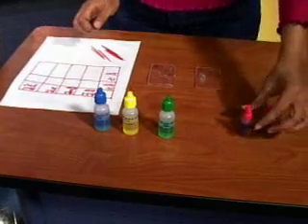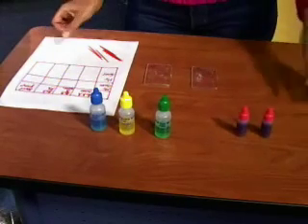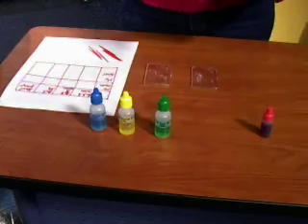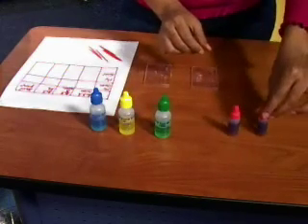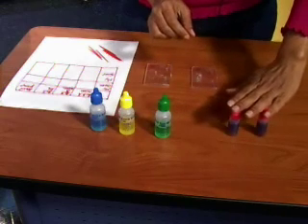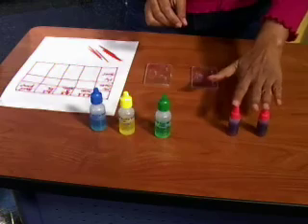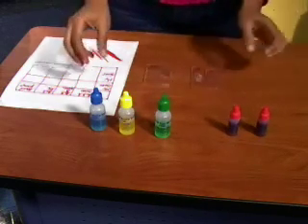I'm going to be discussing blood groups today and how blood grouping is done in a lab. Now here we have two patients. One is Mr. Green and the second patient is Mr. Jones. Now we don't know their blood group. So in order to determine their blood group, one of the things we need to do is make this blood interact with something that we do know.